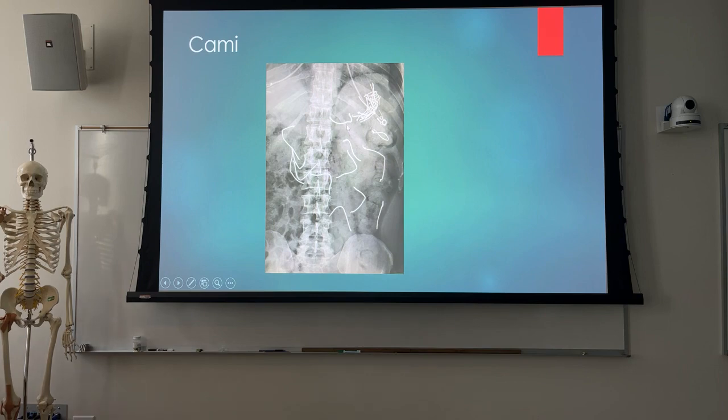I think she was saying it was some kind of lead, eating EKG leads or something. Was this from Rusk? No, remember, this was in Athens. I took these. Oh, really? I guess we might have sent the same pictures. Okay, so they were eating the leads. Yes, he was eating some type of wire.